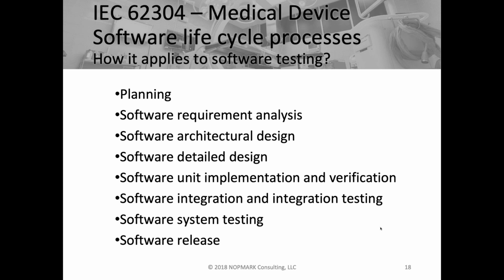And then finally, the software release. One aspect of software release that applies to software testing is what's called your anomalies list or your bug list. If you have bugs in your software that impact your customers, you have to communicate that to your customers. In many organizations, it will be your software tester who maintains the bug list, who has some oversight and control of your bug tracking process. So typically, you'll see your software testers as a key part of the software release in terms of, okay, what are the bugs in your software that customers need to be aware of?